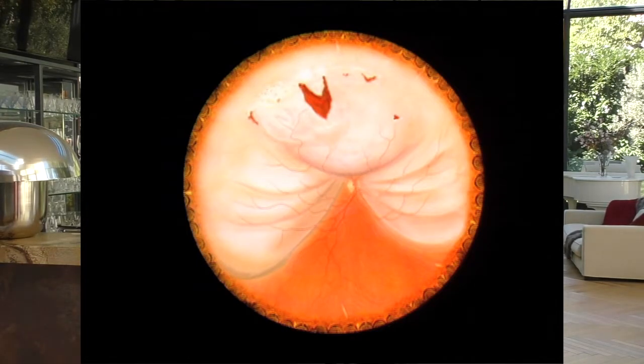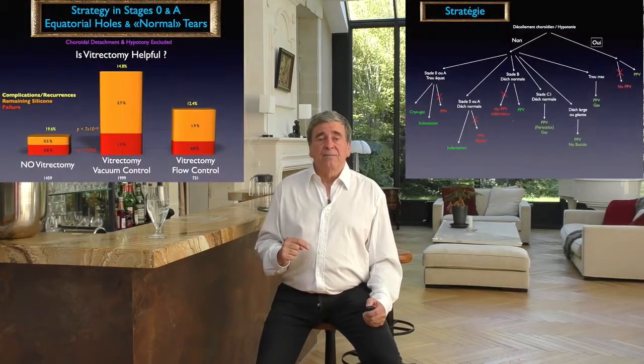In the case of multiple tears involving 2 or 3 quadrants, and therefore requiring a long indentation which may alter the vortex vein circulation, the question of vitrectomy may arise, provided that it does not cause too many complications. And this is where the choice of a machine comes into play, as the IVRS study shows us.